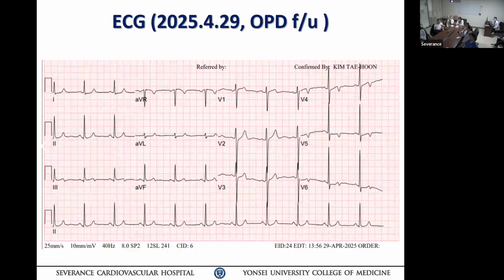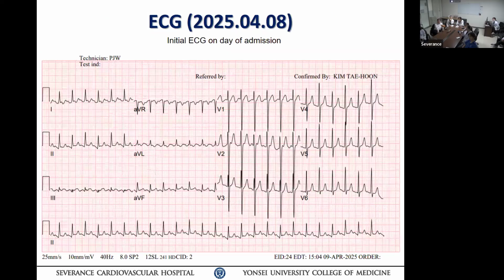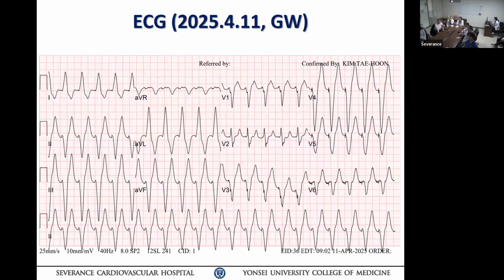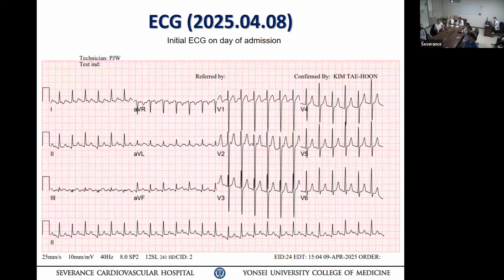So I'm asking how the sinus rhythm ECG differs before pacemaker implantation. Before. No ECG? There's no ECG before that. No.